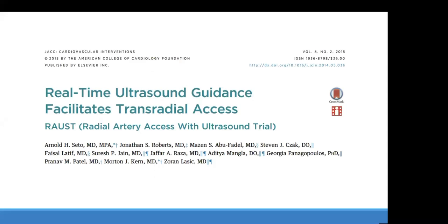And the third method, as I said, which is a little bit fancy, but I've used it, and my fellows did see me use it when I really have to go radial. There is no other option because the patient is obese, on triple therapy, and on anticoagulation. With the ultrasound, you're going to see. Also, I think all of us are now trained with ultrasound or comfortable with it.